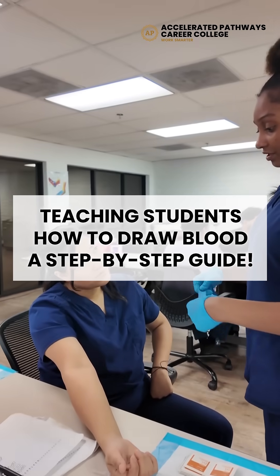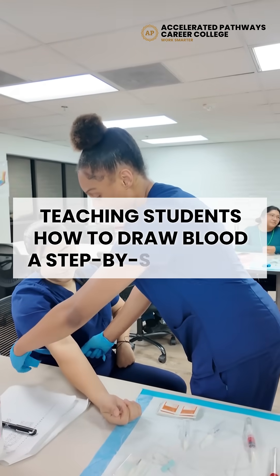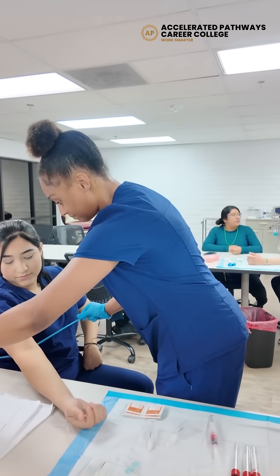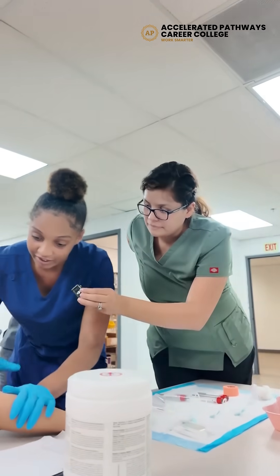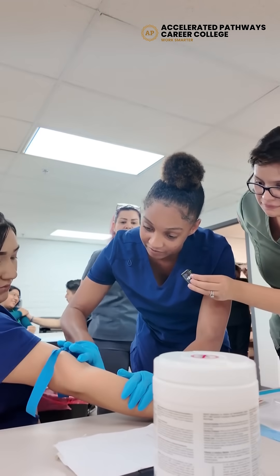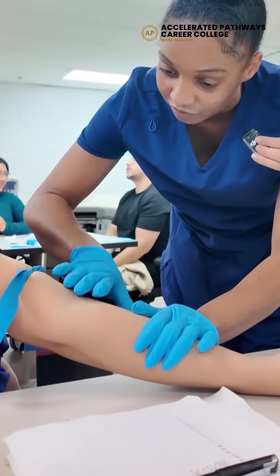What's the first step? Put the tourniquet on. Okay. And then what's the next step? And then I check to see if I can find a vein. And you make sure you always pat it down — don't rub on it.